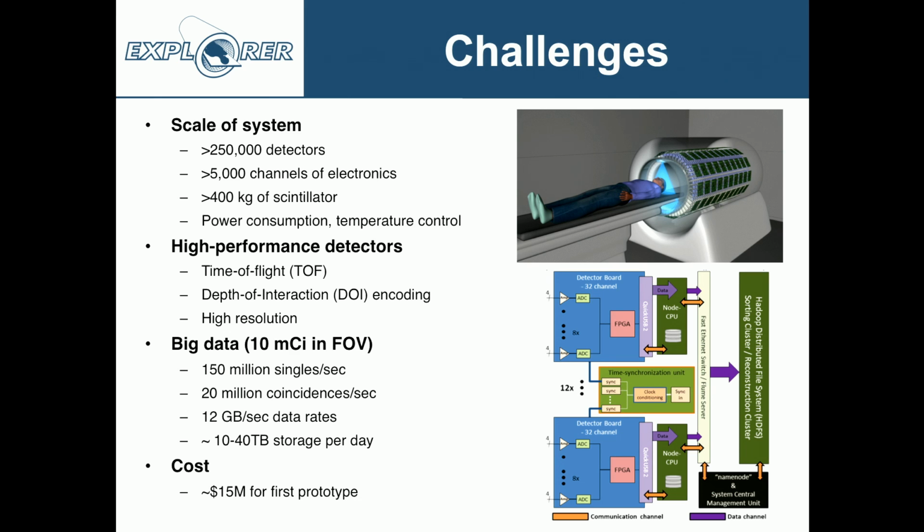The other piece that's quite hard and challenging is the data side of things, how we handle these massive event rates in real time, looking for coincidence timing across all of these detectors at the few hundred picosecond level. This is not trivial, how you sort that data, get it out of the scanner, and then how you, of course, store it and process it in terms of the reconstruction. So lots of interesting challenges on the data side as well. And then a not insignificant challenge at the bottom here, which is how you raise the money to actually build one of these things.